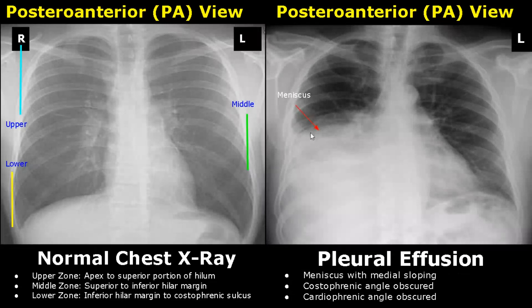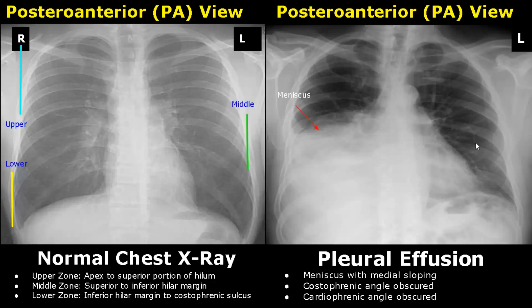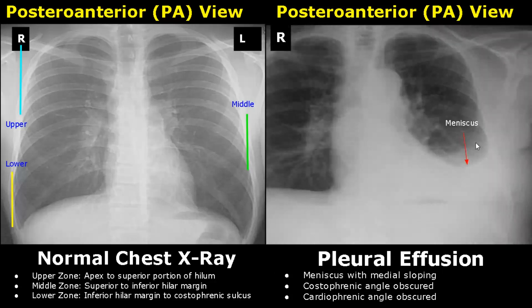In this image the extent of pleural effusion is larger. The concave shaped meniscus is seen again with medial sloping — it is steeper at the medial side. Both the costophrenic and cardiophrenic angles are obscured. Here is a pleural effusion on the left side. We can see the meniscus very well along with obscuration of costophrenic and cardiophrenic angles.